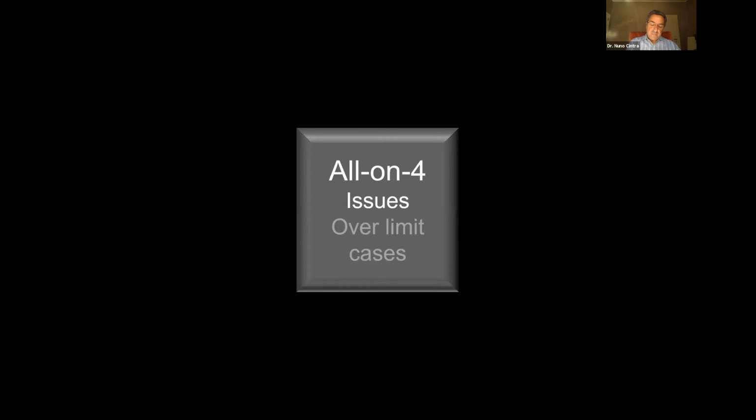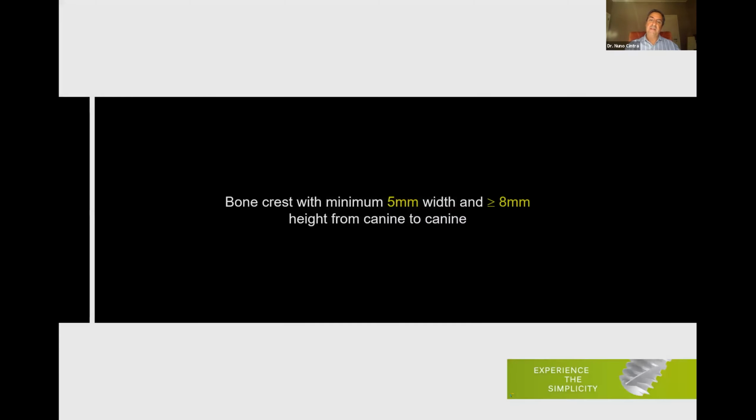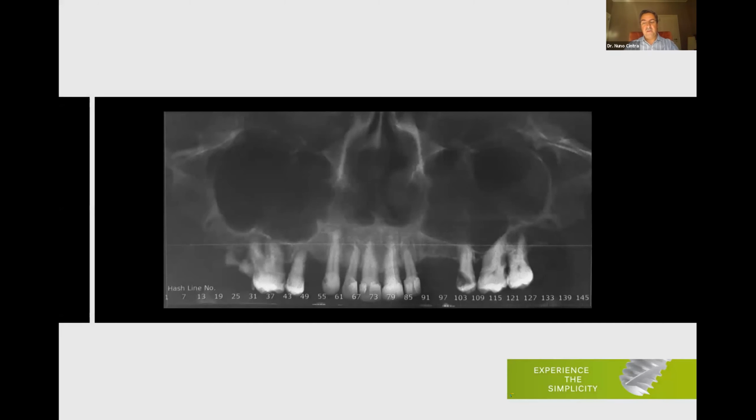implant. Well, sometimes, and a lot of times, we have over-limit cases. By over-limit cases, I mean cases where we don't have that rule of 5 width and 8 length bone available. So we have to think how to do All-on-4 in these situations. Well, one of the solutions is to go through the sinus. Place a situation like this one.